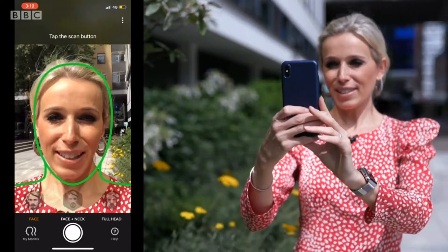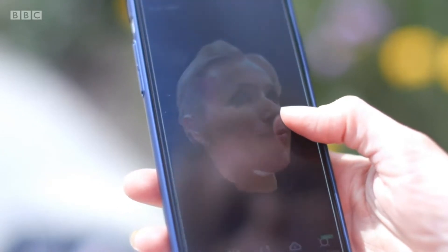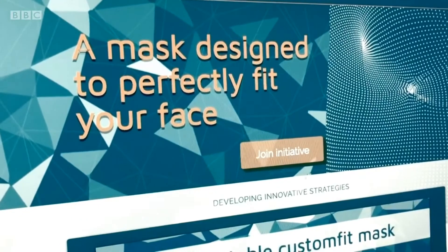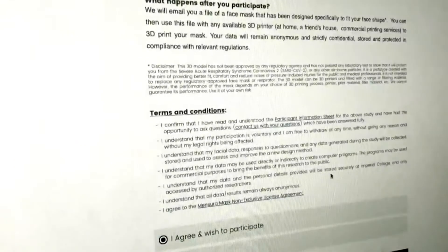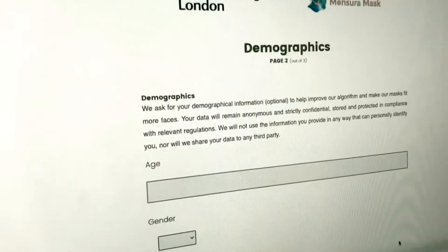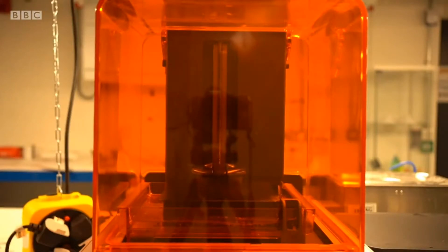Currently you do need an iPhone 10 or above to carry out this process, but alternatives are being looked into, including some for Android users. You then upload your scan to the Mensura mask website. Specially created code is used to extract the necessary data, and that is sent to Autodesk's Fusion 360 platform to tweak and rebuild the model to fit your face. This should provide you with a free file of your mask to print.